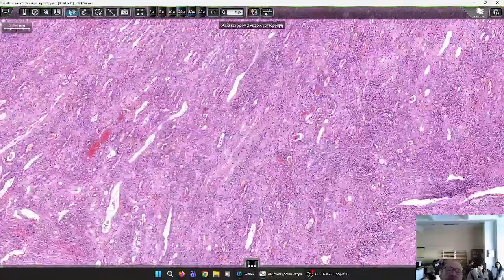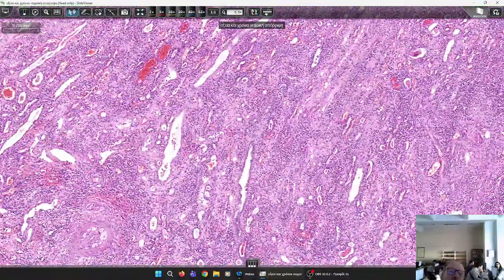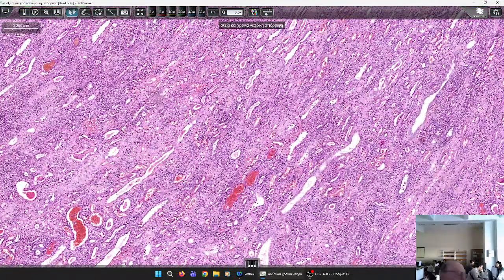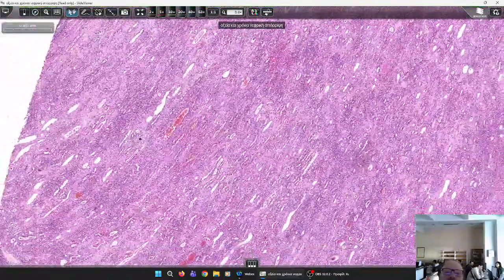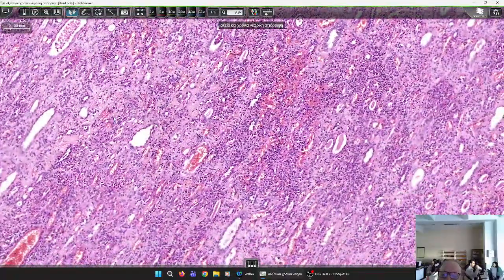We are certain that this is not the ureter, because the ureter is bigger. This is part of the renal parenchyma, not the ureter. If you take a biopsy, you check the cortex. Okay, always. That's the representative biopsy. You check the cortex.